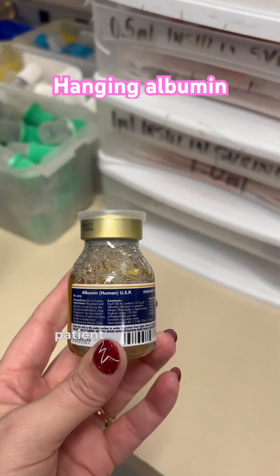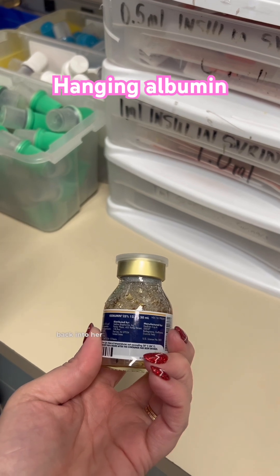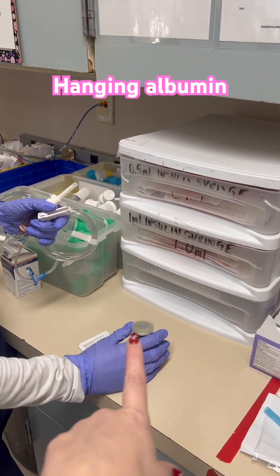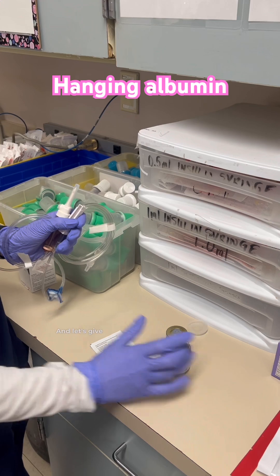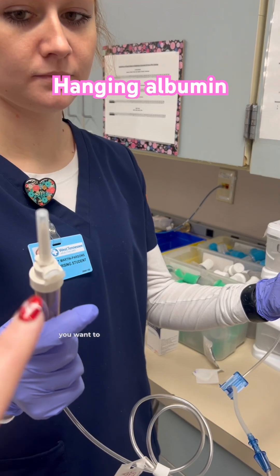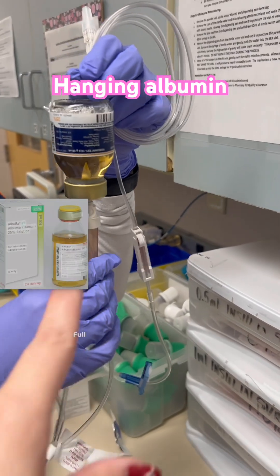We are about to hang albumin on a patient who is very edematous and trying to pull fluid back into her vessels. To prime the albumin, the first thing is to pop off that clear plastic top. Give it a little swirl, then open this door and spike it, filling the drip chamber about halfway.